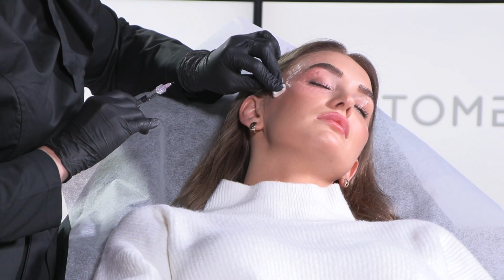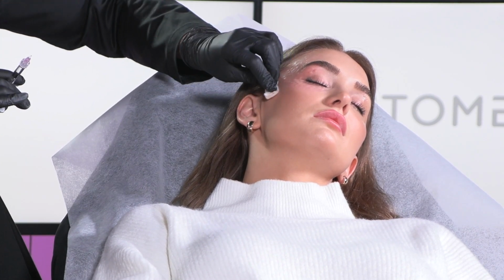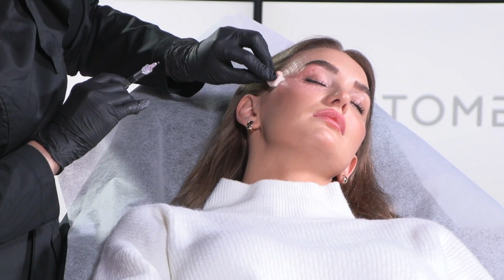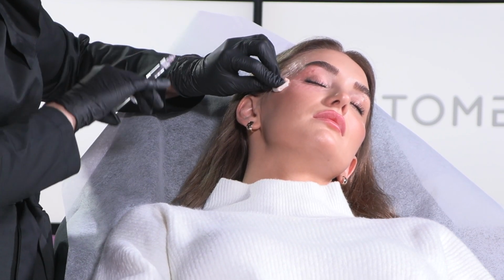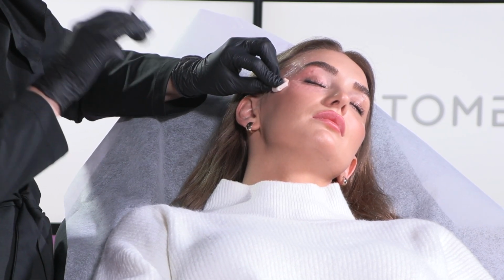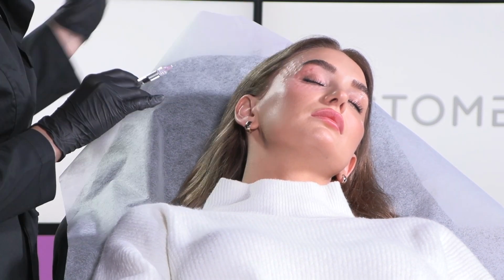How deep do you go? Is it like intradermal, just the normal? Yes. And even here, is it not more superficial? It is superficial, yes. You don't go deep, it's not like a super hydro. You want to influence the skin, and with all the other injections and products, HMW, Classic, Young Eye, you will inject only intradermal into the skin.